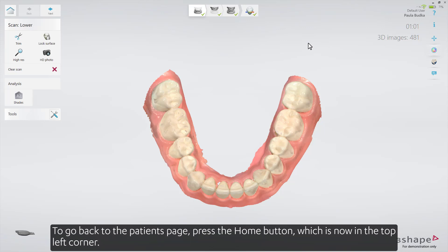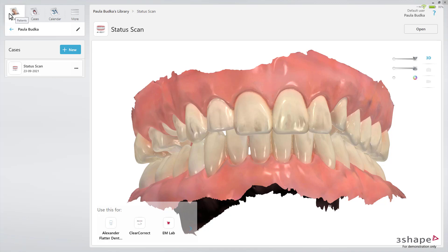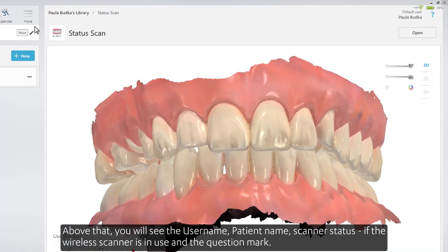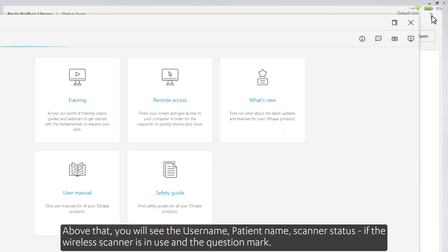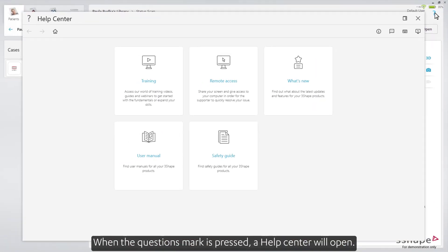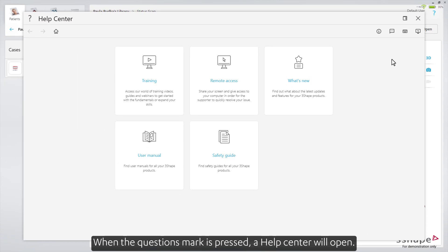To go back to the patient's page, press the Home button, which is now in the top left corner. Above that, you'll see the user name, patient name, scanner status if the wireless scanner is in use, and the question mark. When the question mark is pressed, a help center will open.